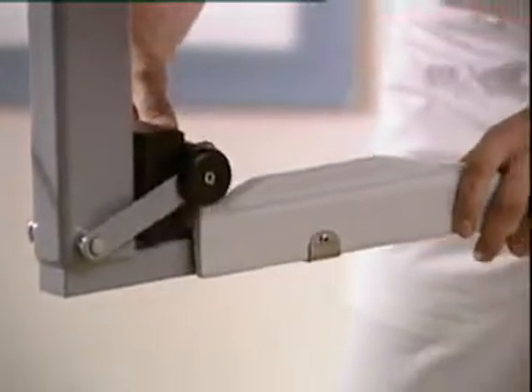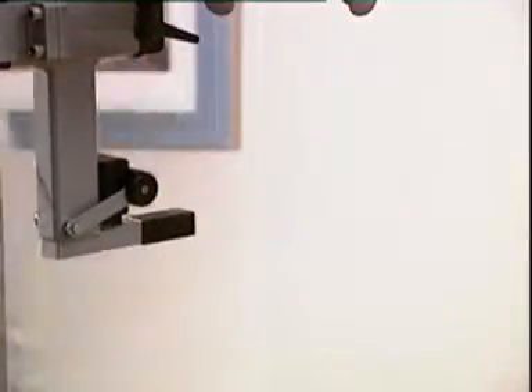The spade seat can be easily removed once the patient is in a comfortable standing position.